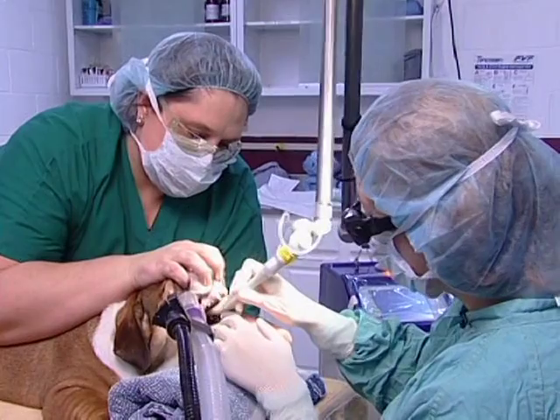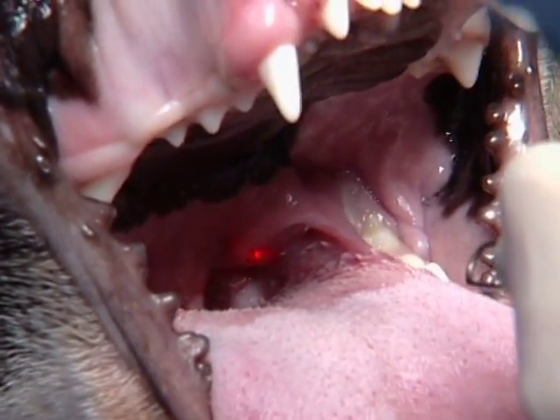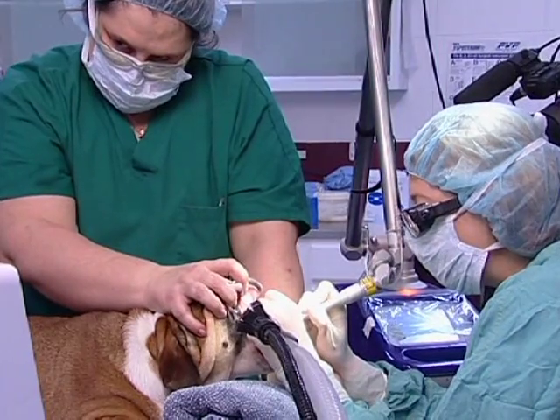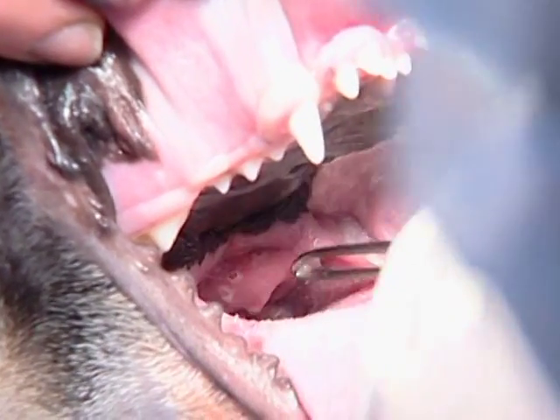The next landmark is our tonsils — they run here. If you look at the red diode, it's where the tonsils are located right here. Now I'm going to make a mark right in between those. I have a series of dots, about five. That's going to be my landmark for cutting.